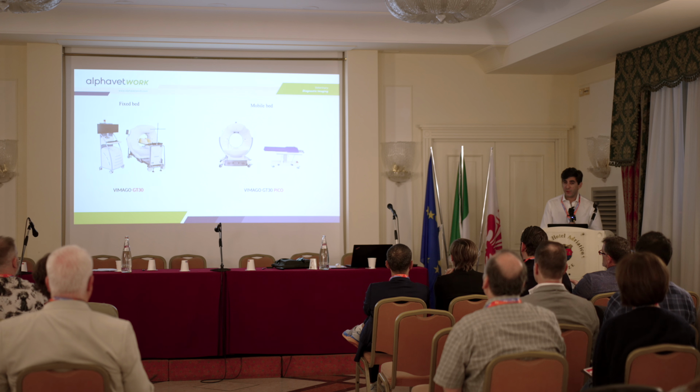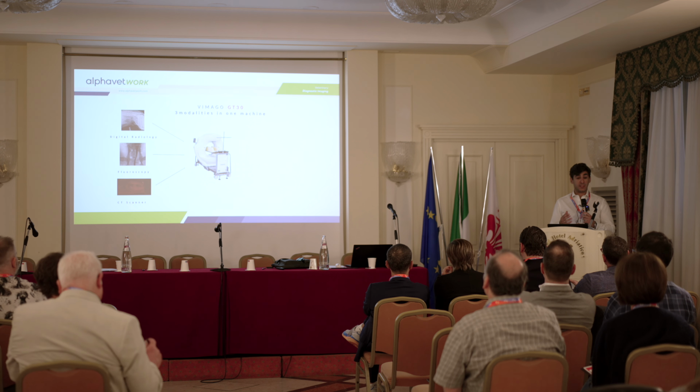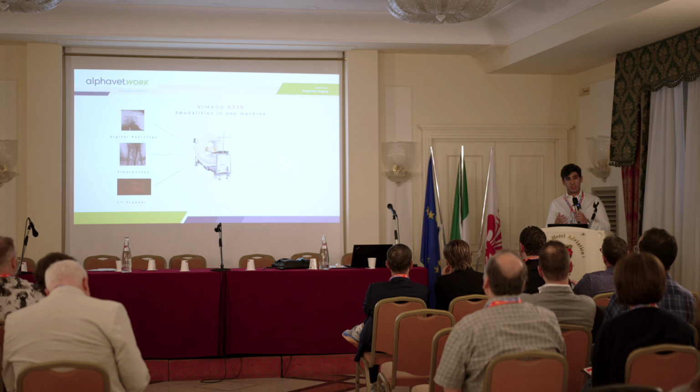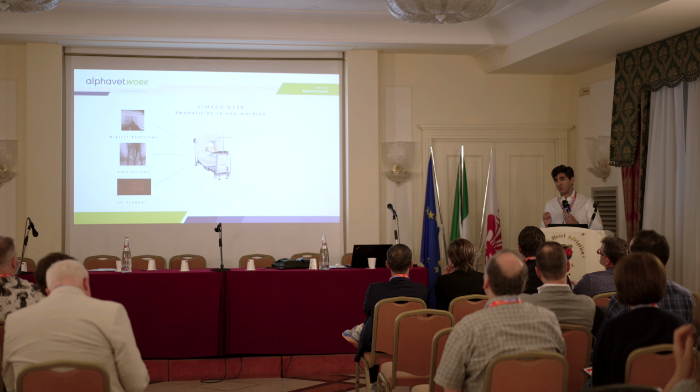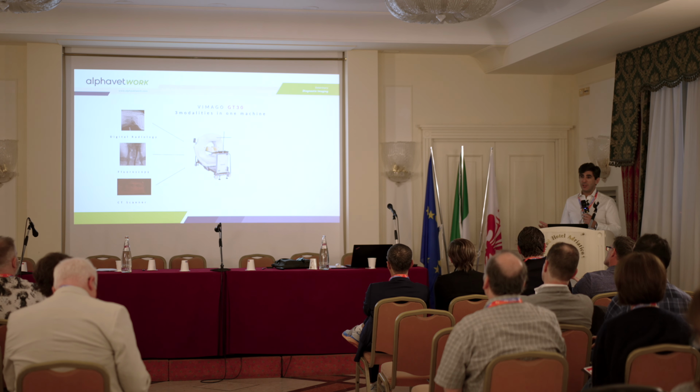So it's very important for us to understand what we can do, what our advantages or disadvantages are, what your caseload is, where your target is, what you want to see. With this machine, you can have digital radiography, you can do fluoroscopy, and you can use it as a CT scanner. So it's a very nice tool to have.